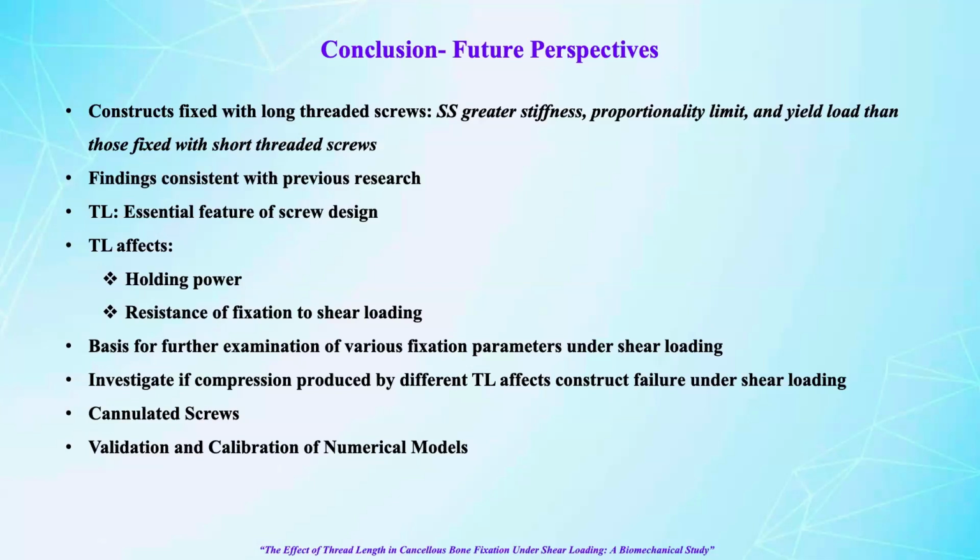Furthermore, this study may serve as a basis for further examination in this relatively unexplored field. In addition, more research can be conducted on the mechanical response of cannulated screws that are more commonly used. And finally, the experimental data of this study may be used for the validation and calibration of numerical models for the simulation of the specific fixation problem.